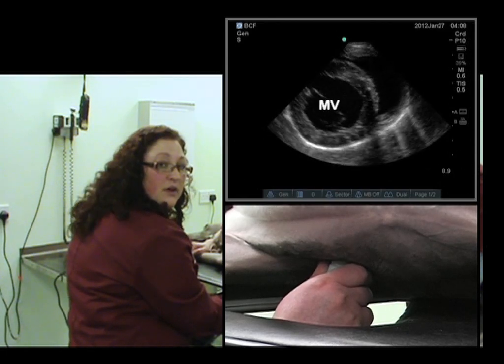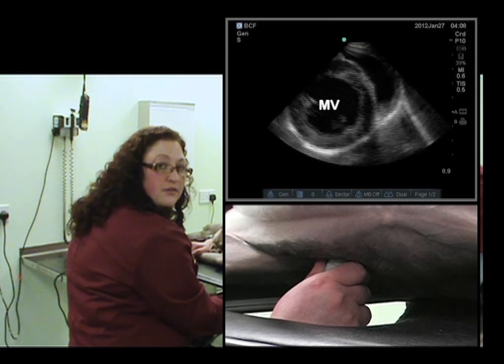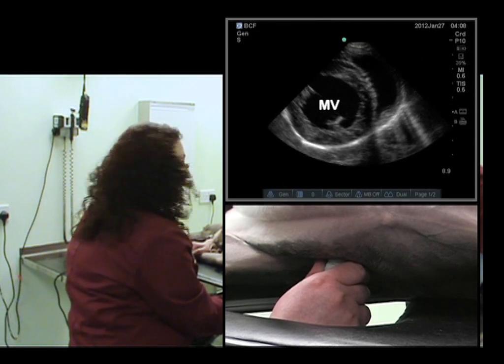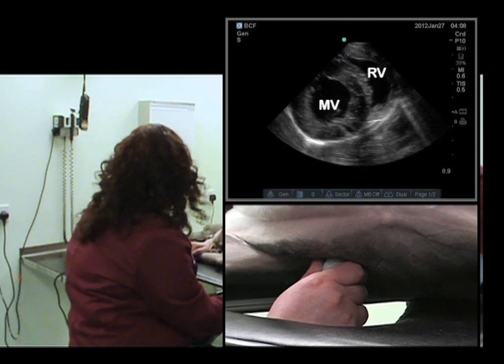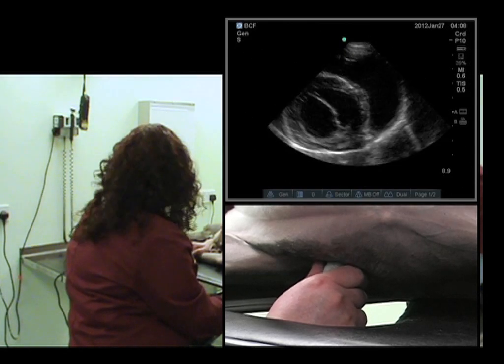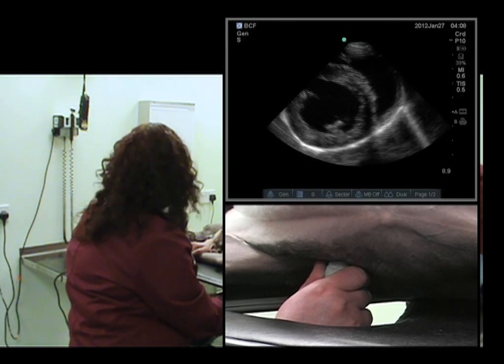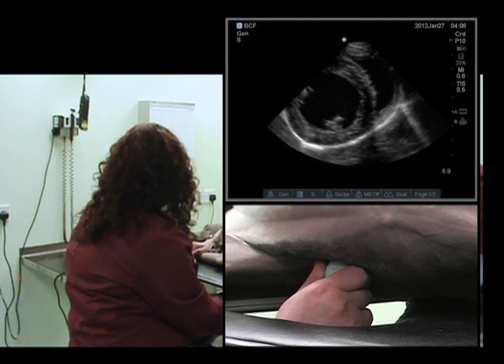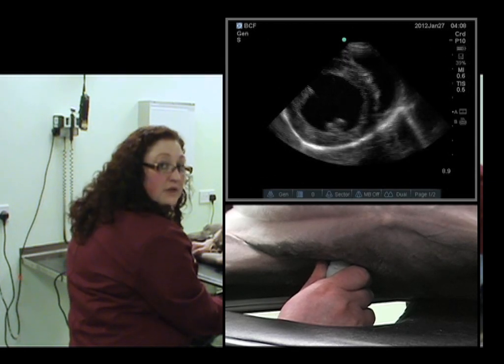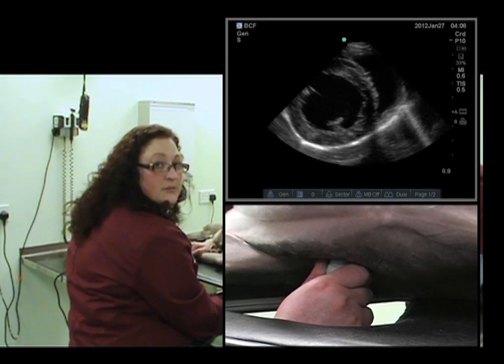We can look at the mitral valve leaflets, the left ventricular contractility, and the right ventricle wrapping around. You will have noticed a moment ago that we went back into the mushroom view. What we actually need to do is fan cranially to achieve the fish mouth view.